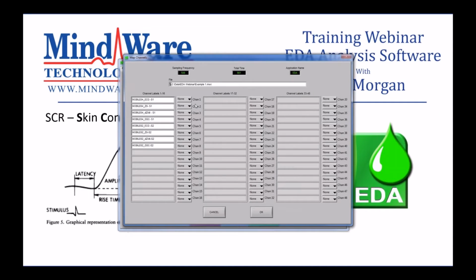So the first thing that happens after we open our file is the application wants to know what channel is mapped to what signal. Because just because we labeled them well when we were acquiring them doesn't mean that that channel definitely contains that signal. So for EDA analysis, the most important signal to map is obviously EDA. And as I mentioned earlier, sometimes at MindWare we refer to it as GSC. So I'm going to come down here to the first subject and choose EDA as that channel.